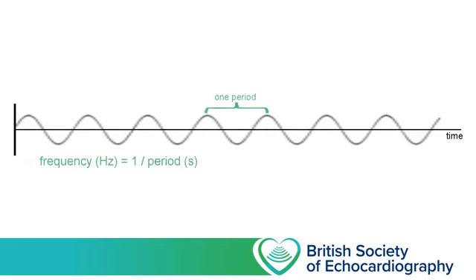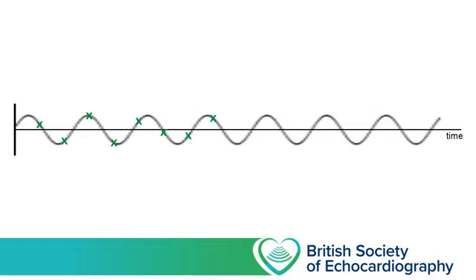But what if we can't see the entirety of a wave? If we sample the returning wave's amplitude at regular intervals, then we might be able to get enough information to build up a picture of what that wave looks like. So here we have 8 green X's, and by knowing the position of these 8 green X's, we're able to describe the wave which must have created them.